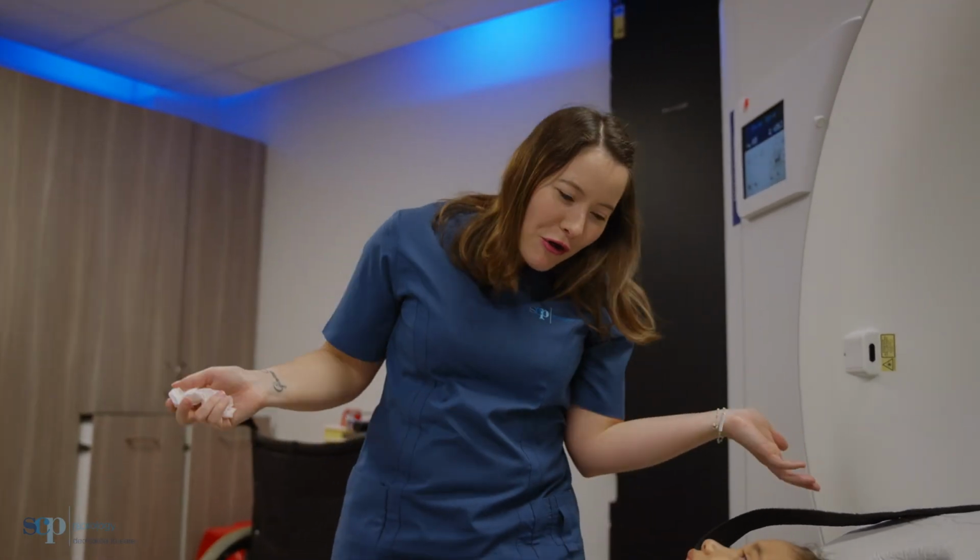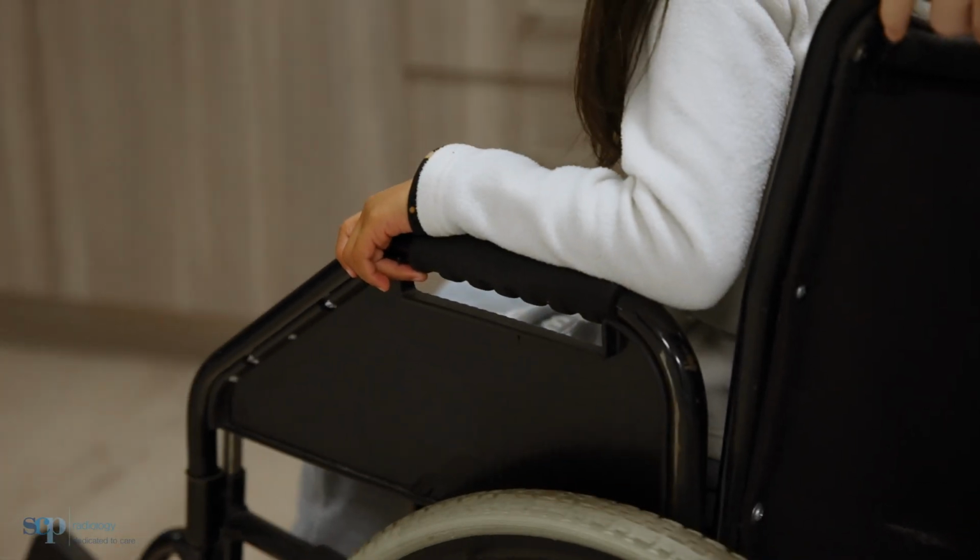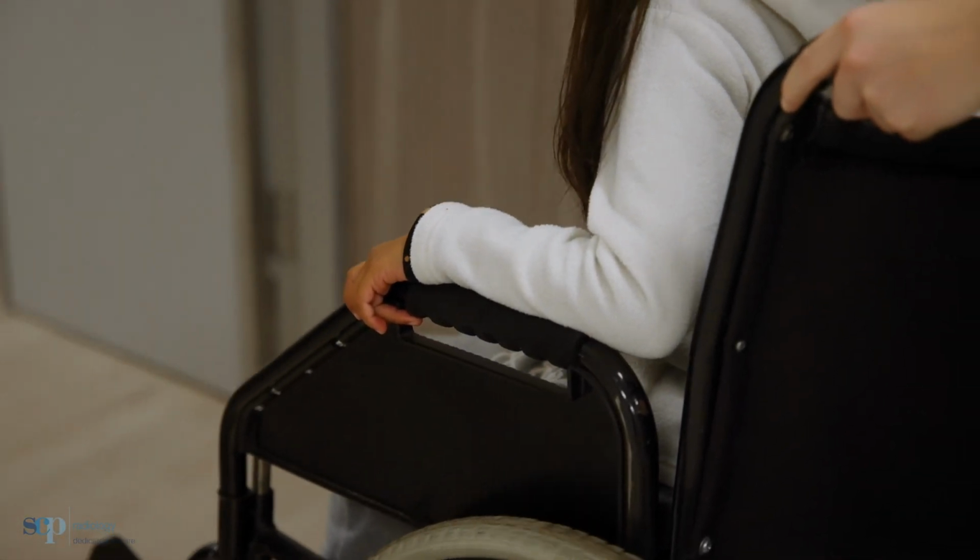In less severe injuries to the brain, for instance, small surface hemorrhage or small parenchymal hemorrhage that don't need surgical intervention, follow-up imaging would be important to make sure that these lesions or injuries resolve. So typically the clinician will ask for a follow-up CT in 1 to 2 days, and sometimes again after a week.